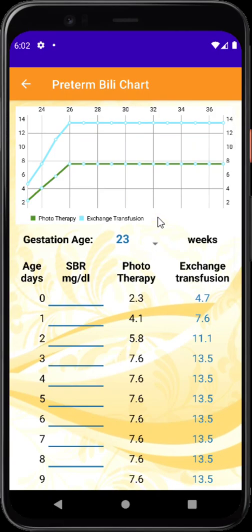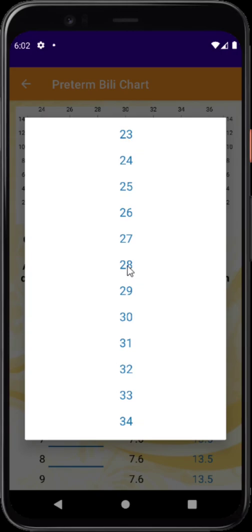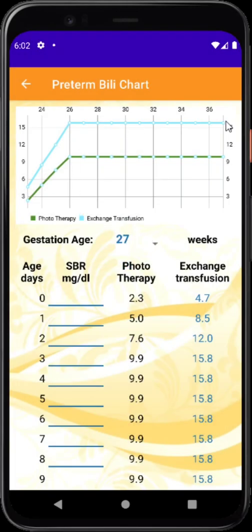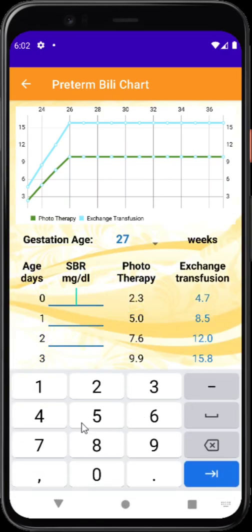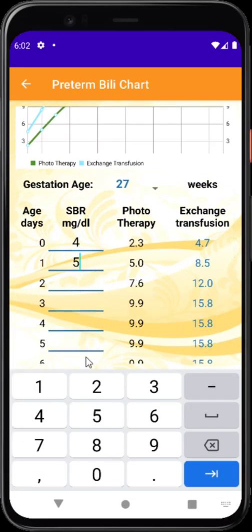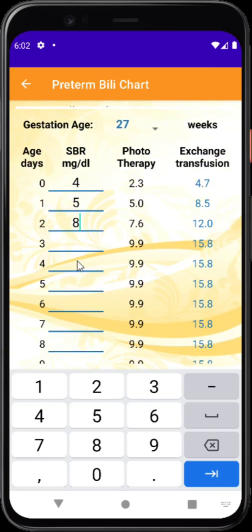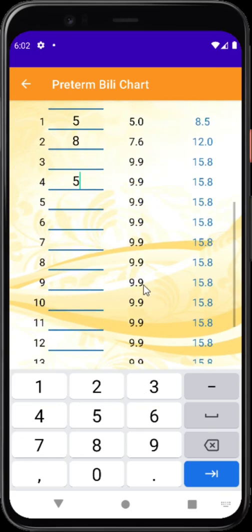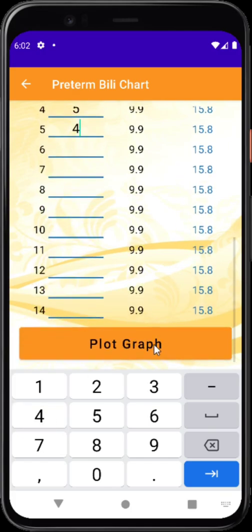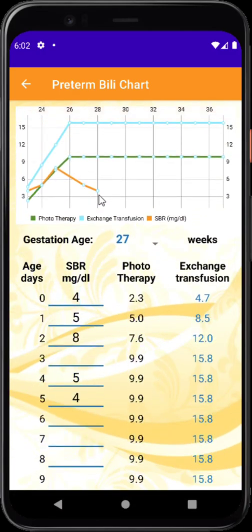Similarly, there is an interactive preterm bilirubin chart for deciding phototherapy and exchange transfusion, based on NICE guidelines. First, select the birth gestation — say 27 weeks — and a reference chart appears. Enter bilirubin values over time — say 4 on day 0, 5 on day 1, then 8, then down to 5 — and plot the graph. The observed values are plotted: anything beyond the first threshold line requires phototherapy; exceeding the second line indicates exchange transfusion.